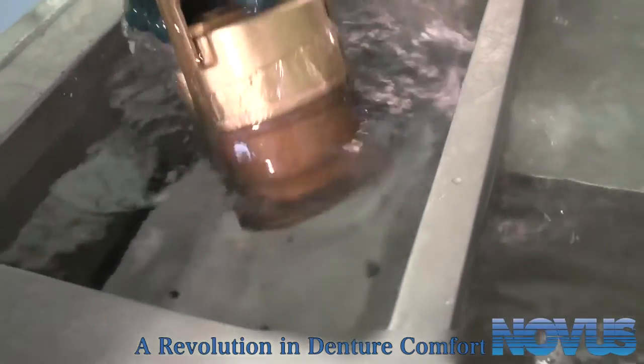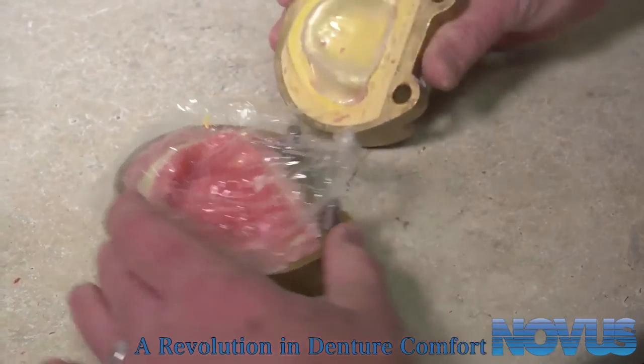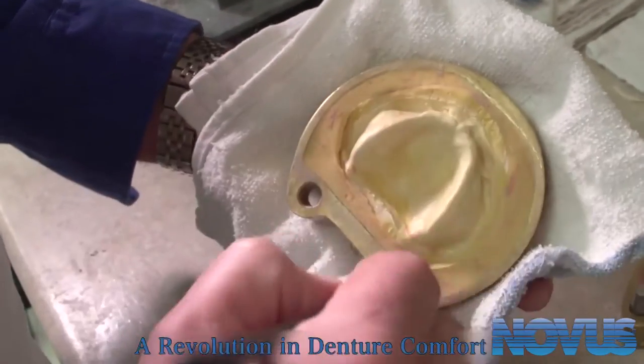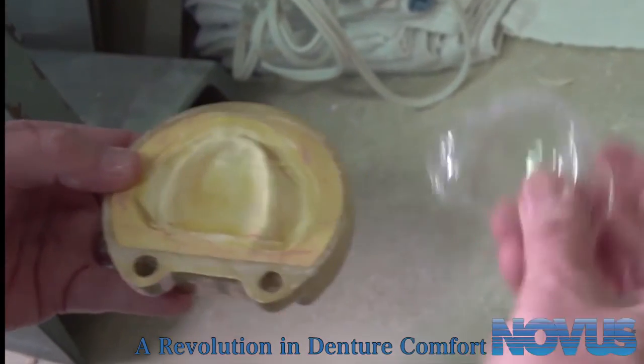Once cured, take the flask out of the water and cool. Carefully separate the bench-cooled flask halves. Next, make any repairs needed to the cast and/or investment. Then, reapply a separating agent like liquid foil. Let dry. Remove the spacer once the flask is dry.